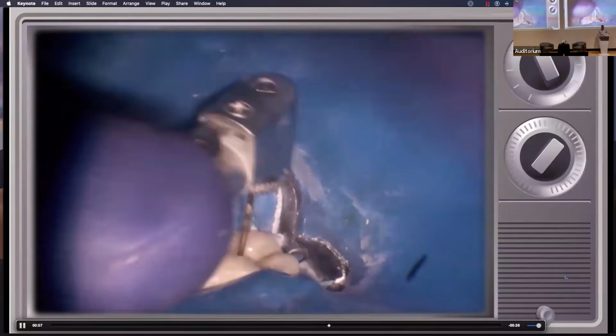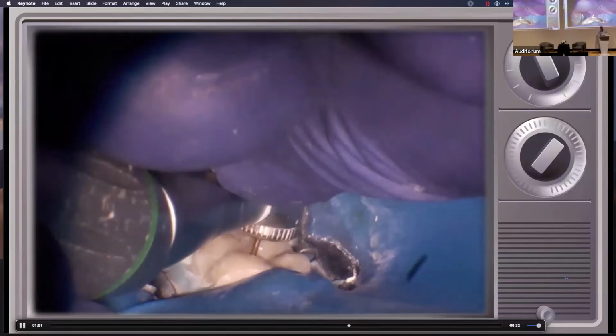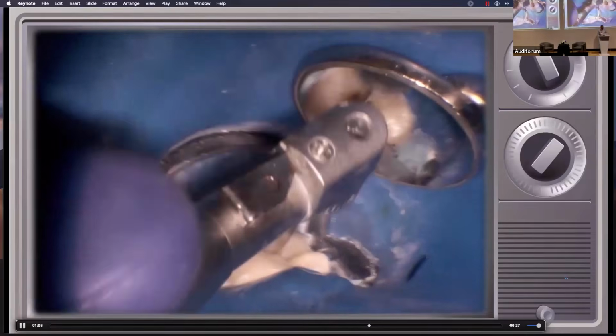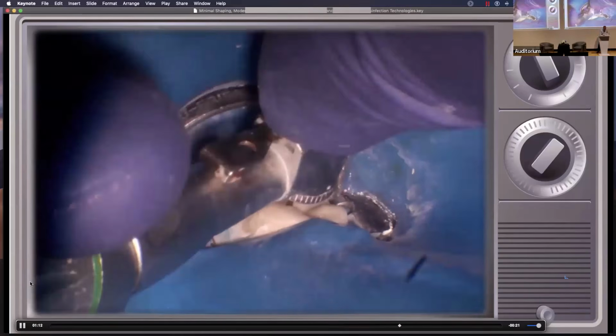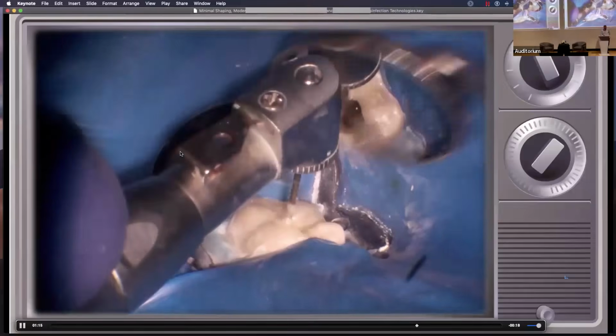Back into the MB. That's a 24. That's a 17. These are just one pass. I'm just going right down. That's 23 or so. So these are basically falling down the canal. Not quite, but they're kind of falling down the canal. I'm not having to work at it to get them to go down. And the DB and the DL.